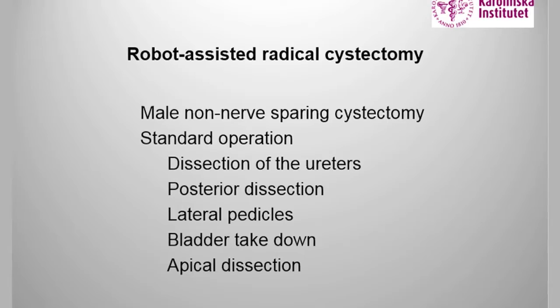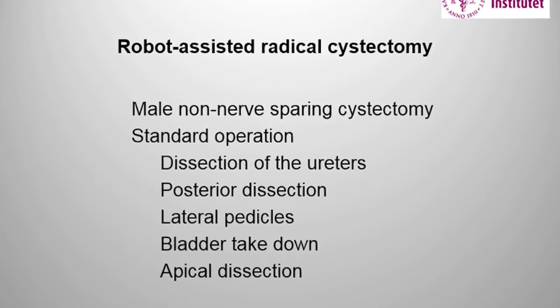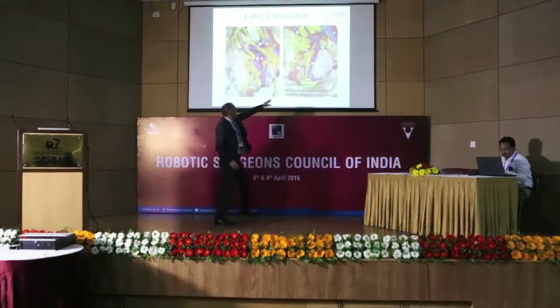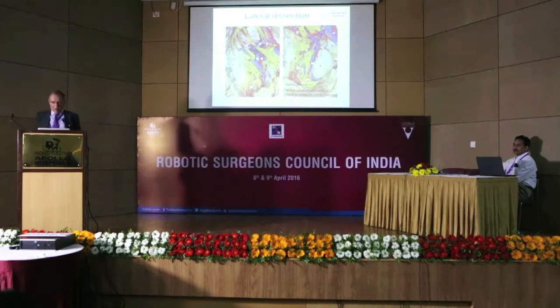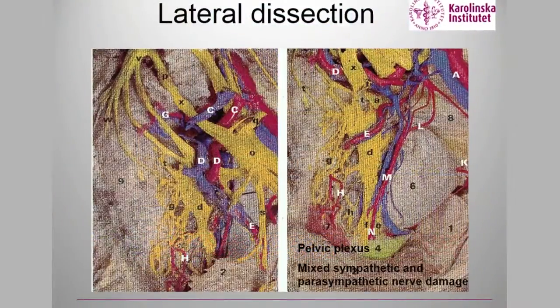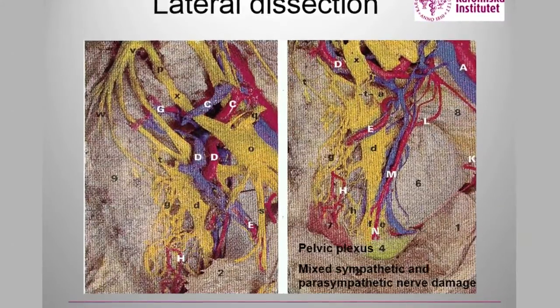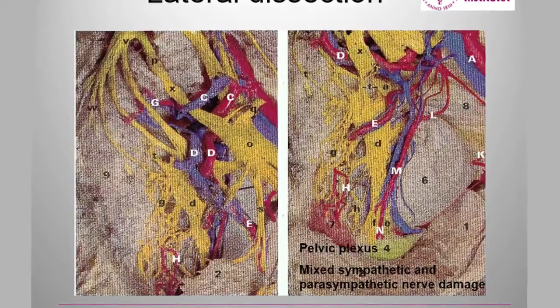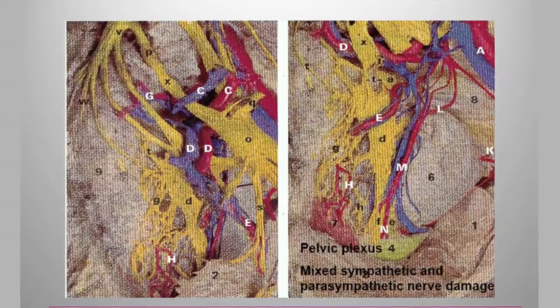First we always dissect the ureters, then do a posterior dissection, go lateral, take down the bladder and do the apical dissection — always the same way. With the robot there is an advantage: you see small anatomical details. You can see the bladder, the prostate, and all the yellow — basically the nerves going down on the side. You can see the pelvic plexus, the seminal vesicles, the prostate and bladder, and understand how easy it is to damage this plexus when you do a cystectomy — not only during prostatectomy but also at this level.